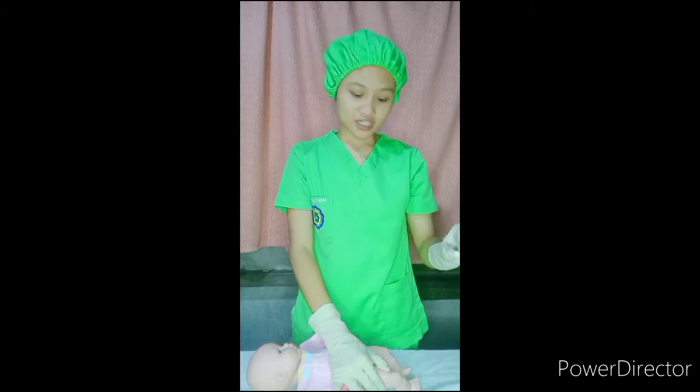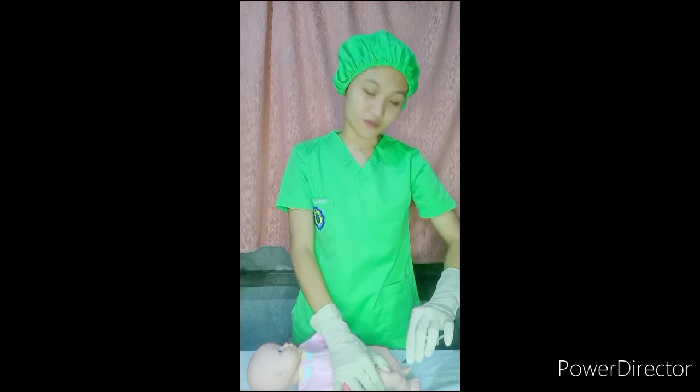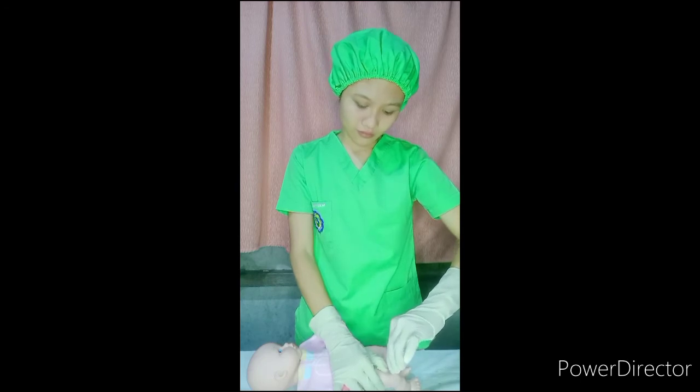And hold the syringe with your dominant hand between your thumb and forefinger and inject the needle quickly at a 45 to 90 degree angle. After the needle is in place, release the tissue, and if you have a large skin fold, pinch up.